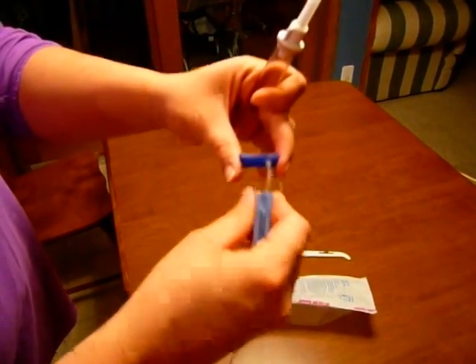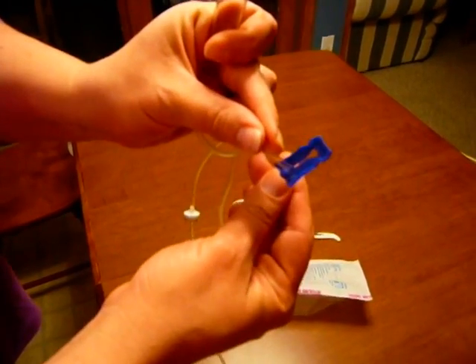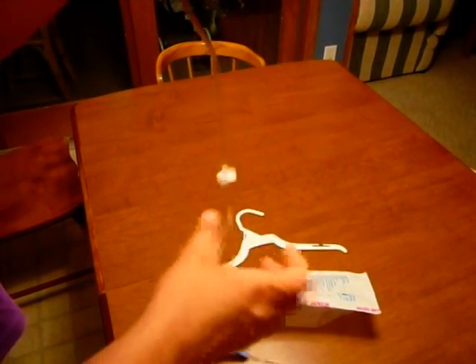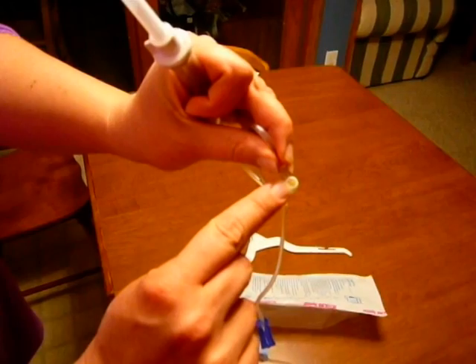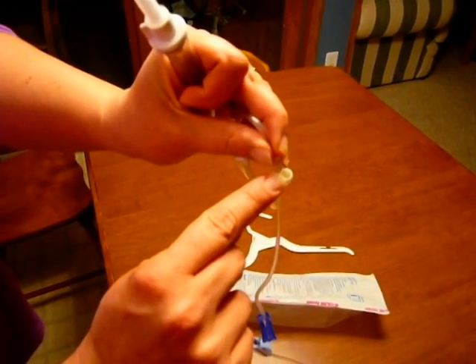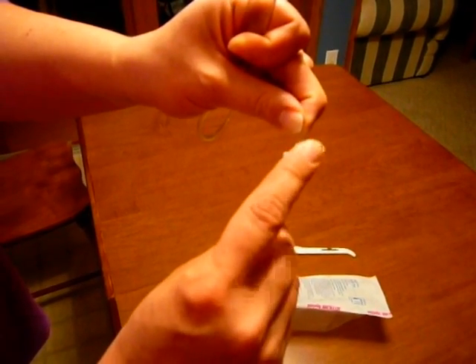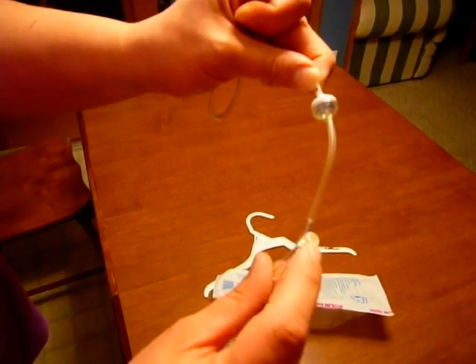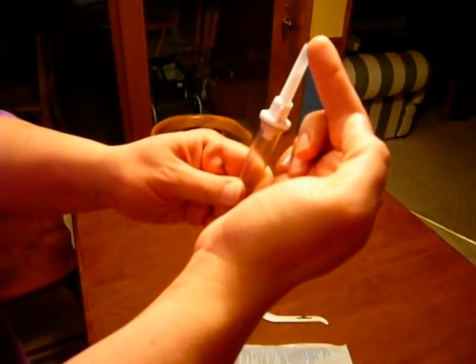The other parts of the tubing you'll notice: this is a blue slide clamp. A slide clamp means that you can slide it across and clamp the tubing like that — that's closed, this is open. There are injection ports where we can access to inject IV medications through, either by piggyback or by injection. And then there's an anti-reflux valve right here. What this does is it does not allow any medication or fluid injected below this point to ever go back up through the drip chamber and up into where the IV bag is going to be hanging.